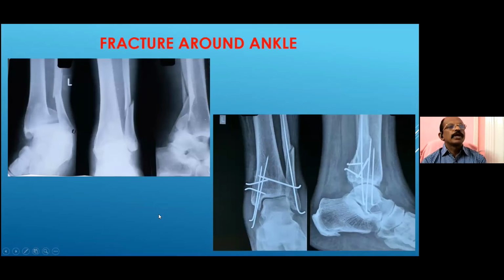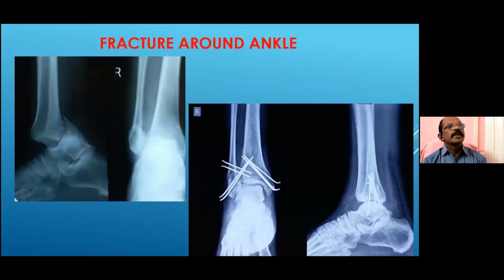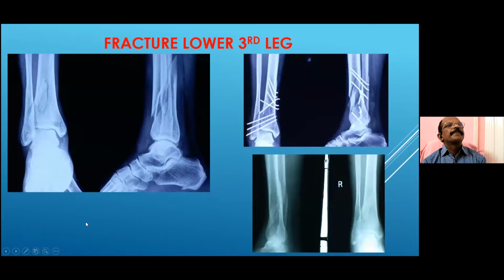And this is a fracture around the ankle. This is a posterior malleolar fracture, and also this lower third fibular fracture is there and fixed with the closed reduction percutaneous pinning, both posterior, medial, and also these fibular fractures. This is a fracture around another ankle. This is a trimalleolar fracture, and which is also fixed with the same technique.